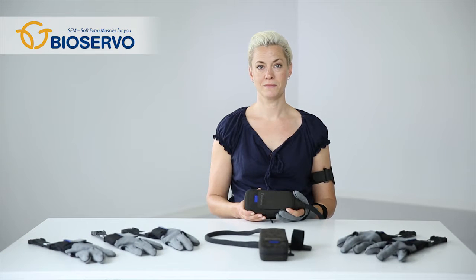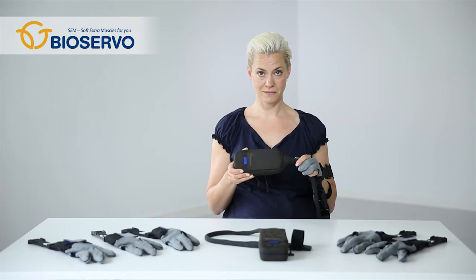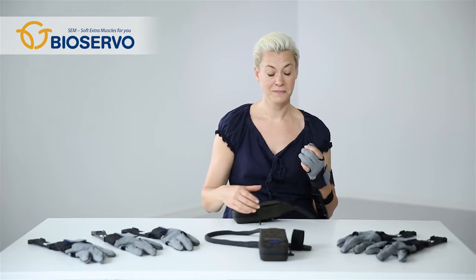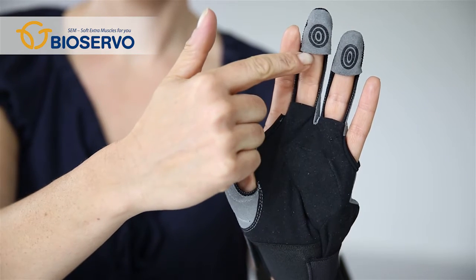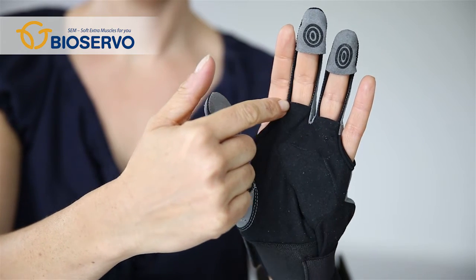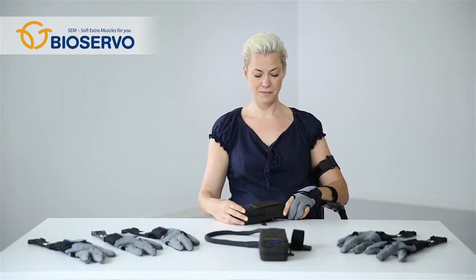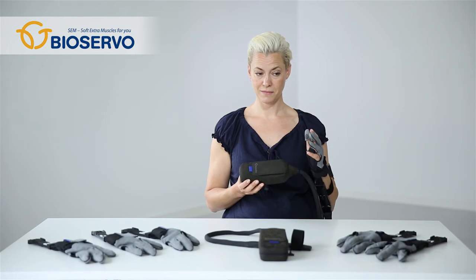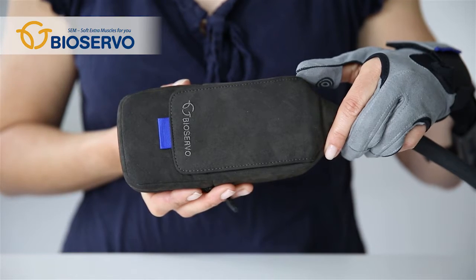This is the SEM glove. The glove consists of two main parts: a glove and a control unit called the SEM unit. The glove is available in different sizes for both left and right hand. At the fingertips there are touch sensors and artificial tendons are sewn into the glove along the length of the fingers. The artificial tendons connect the glove to the SEM unit. The SEM unit contains motors, one motor for each finger, a microcontroller that controls the functionality of the SEM glove, and rechargeable batteries as a power source.